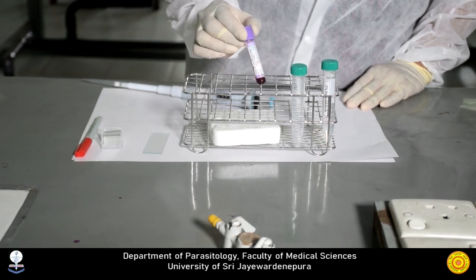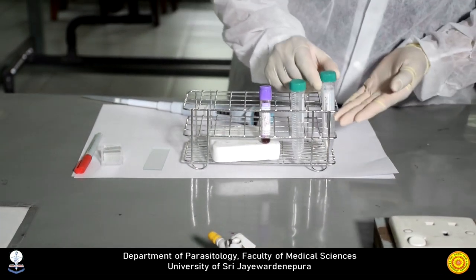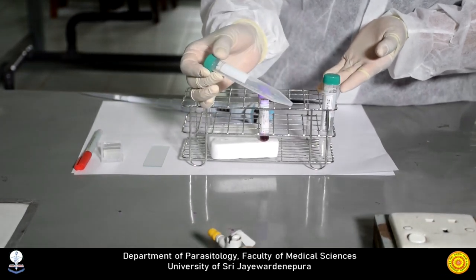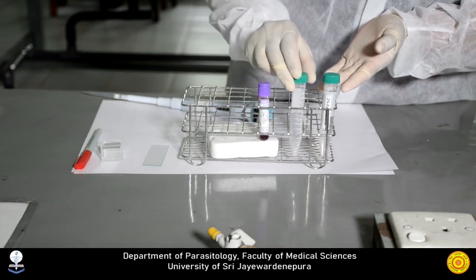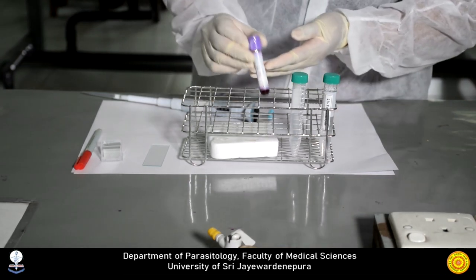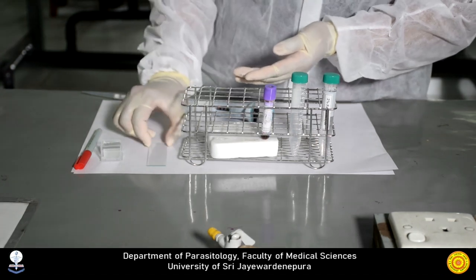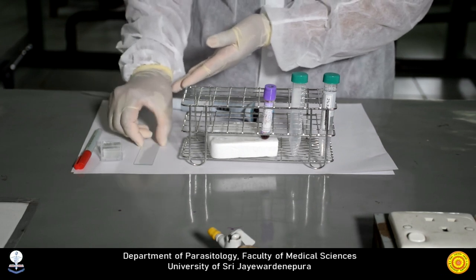These are the materials and the reagents needed. We need 2% formalin. We need a centrifuge tube, a 15 milliliter centrifuge tube. And then we need anticoagulated blood. We need microscopic slides, a few microscopic slides, and some cover slips.